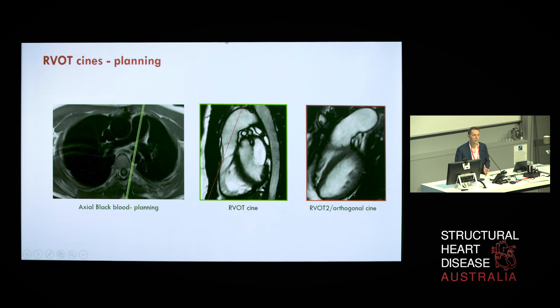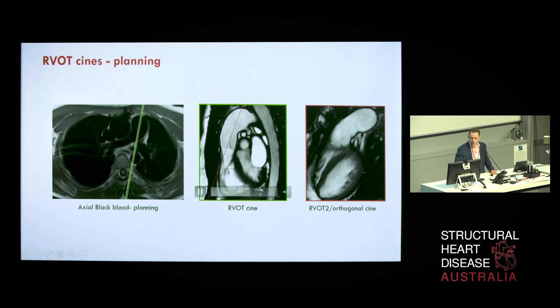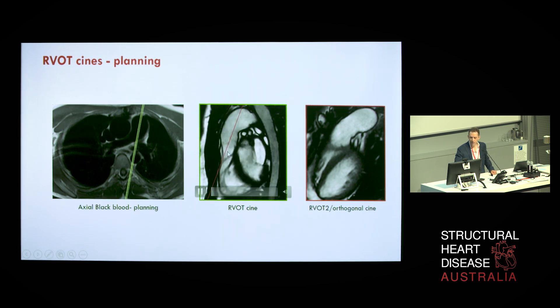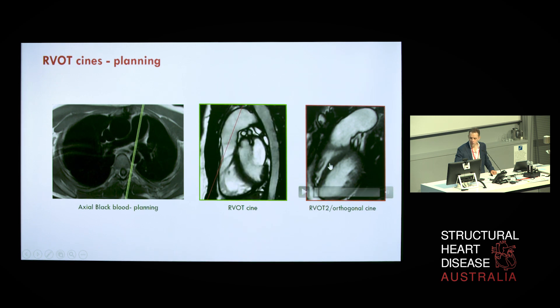The next step is assessing the right ventricular outflow tract, done by reverting to imaging planning from black or white blood images. You can appreciate the main pulmonary artery diverging into its branches, and an oblique sagittal image passing through the main pulmonary artery generates the RVOT cine — showing the anterior wall of the RV, the pulmonary valve, its distensibility, the RVOT's distensibility, and any dilatation of the main pulmonary artery. An orthogonal second RVOT view is then acquired.